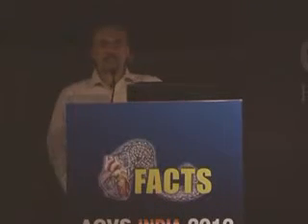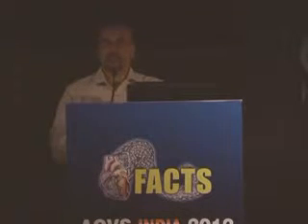The other problem is that when the ascending aorta is short, you may not be able to swing the Amplatz catheter from the left coronary ostium to the right coronary ostium. It may be difficult, and the entire catheter can just buckle in the aorta. These are the problems with this catheter.